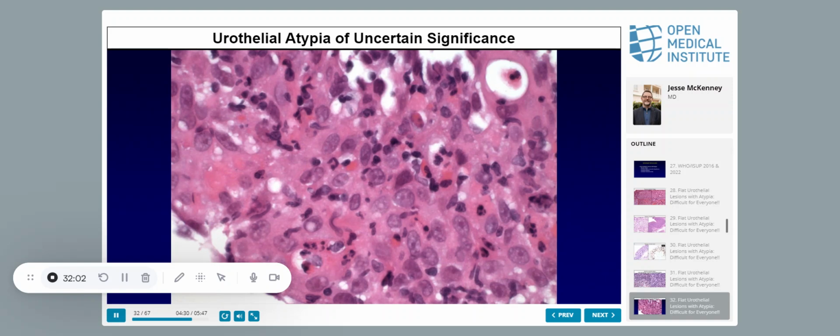Does it matter if the patient has another papillary tumor, and does it matter how to write it if he has a papillary urothelial carcinoma, and can we write this CIS more? Okay, the way I'm interpreting this question is, what if there's a papillary lesion, does it affect how you do the flat lesion? In general, if they're in the same container and the papillary lesion is high grade, it's probably just the base of the high grade.